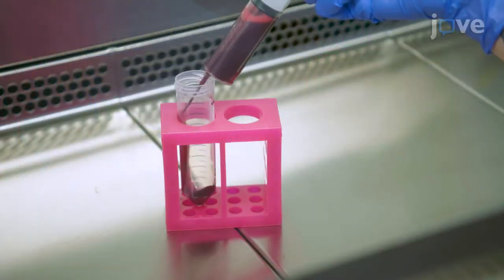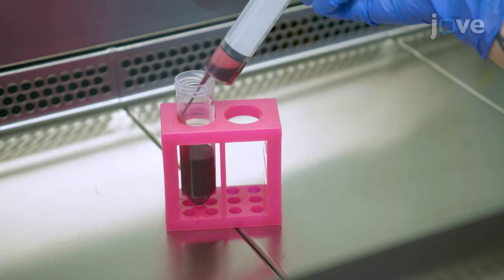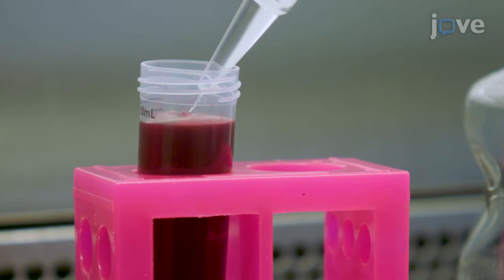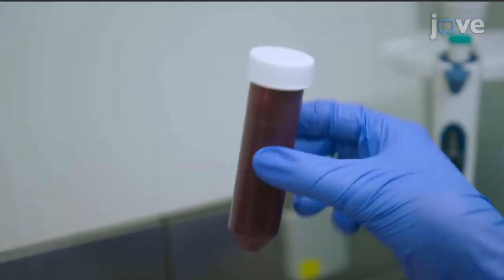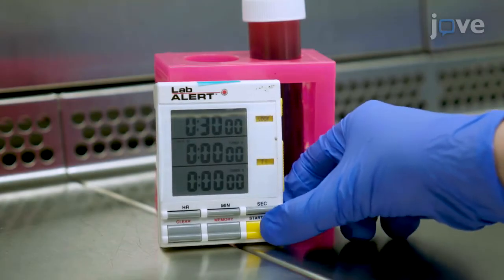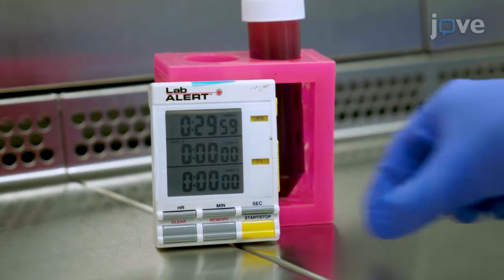Transfer the collected red blood cells into a new 50ml tube and dilute the cell suspension by half with 2% dextran. Mix well to aggregate the blood cells and allow the cells to sediment for 30 minutes at room temperature.